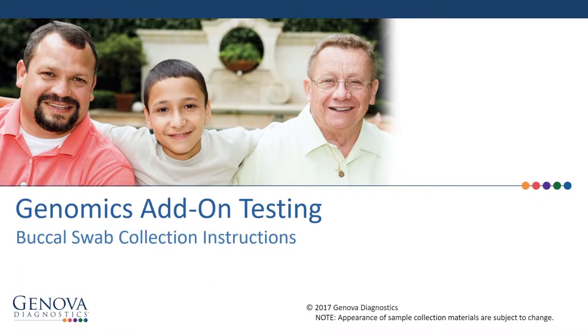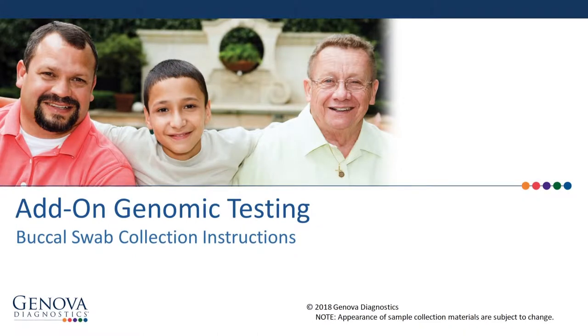How to Perform the Buccal Swab Collection as an Add-On Test. These easy steps will help you successfully complete the DNA collection needed for genomic testing.